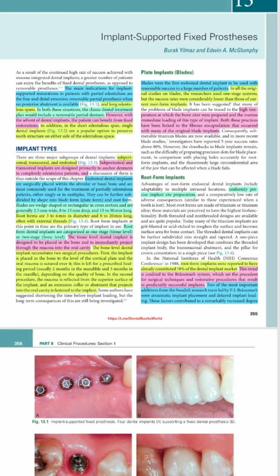Hello and welcome to an important episode of Implant-Supported Fixed Prostheses. We will have a brief explanation about the implants, their history, their types, their procedure of implantation, and the restoration, with a lot of clinical cases that will make this procedure more clear and give us details about some tips and tricks to get the most aesthetic and biomechanically efficient result.